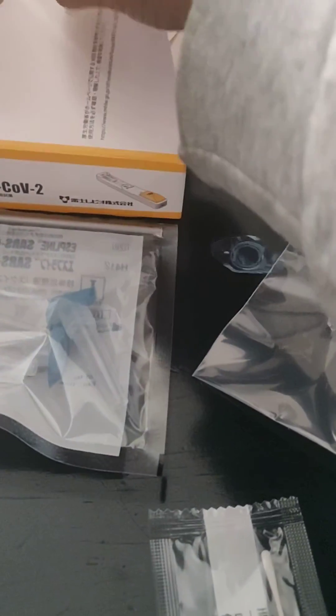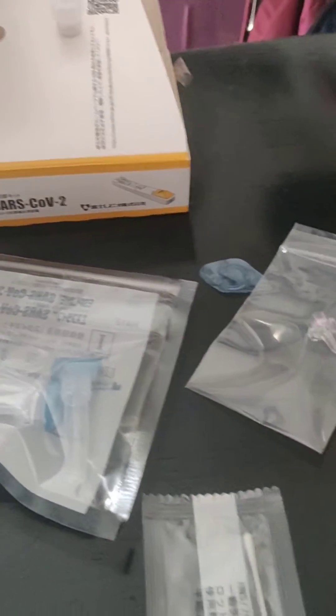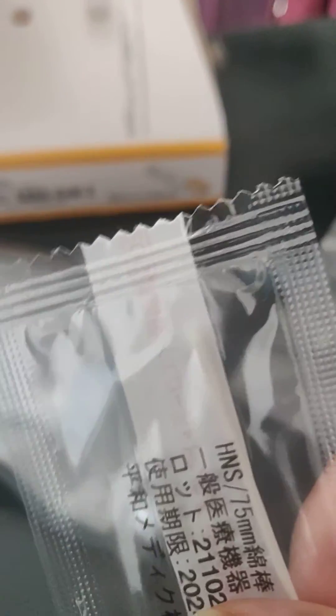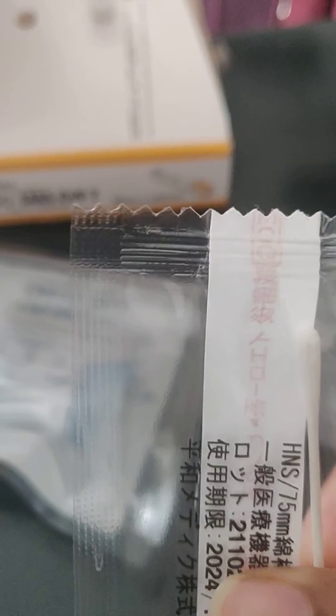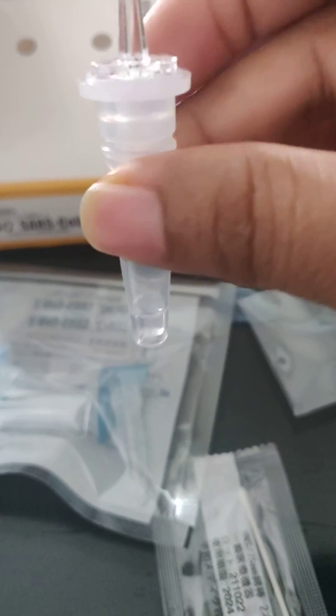After twisting and collecting the nasal sample, you're going to place it into this tube. There is a liquid inside it, and we are going to put this nasal swab — which contains our nasal contents — into that liquid. Then twist it and press it so that all the nasal fluid is mixed with the chemical.